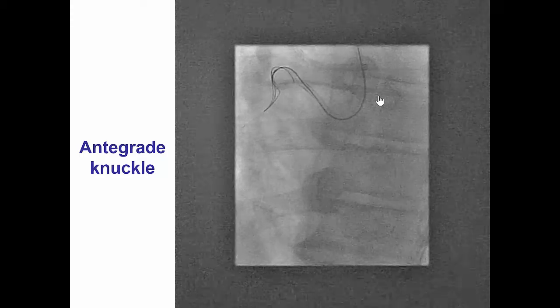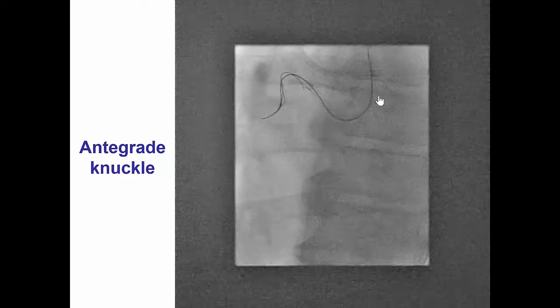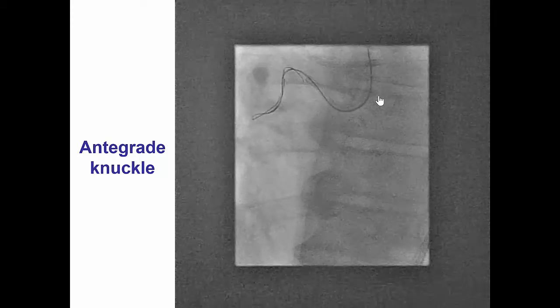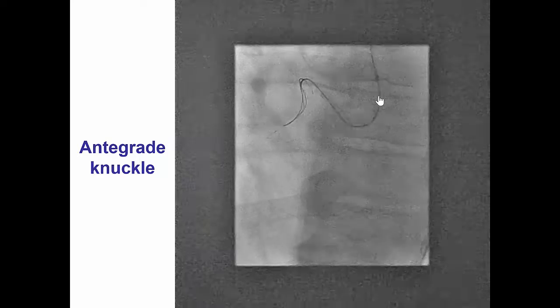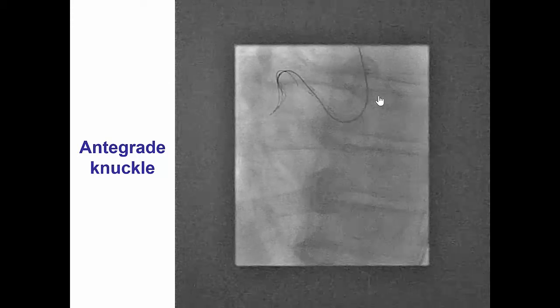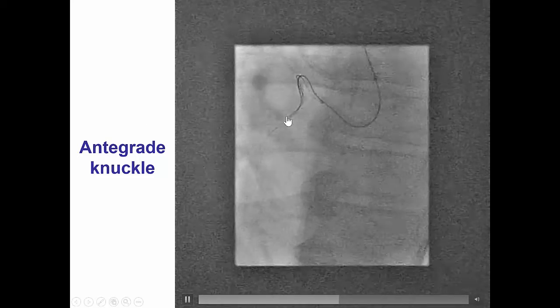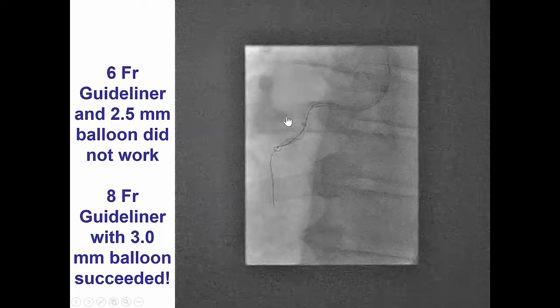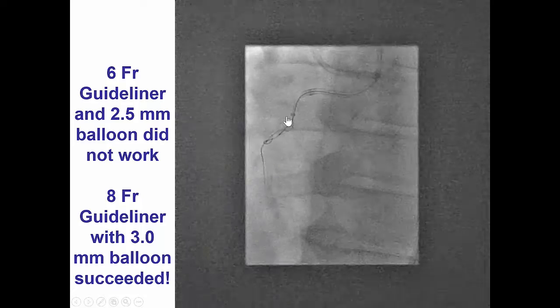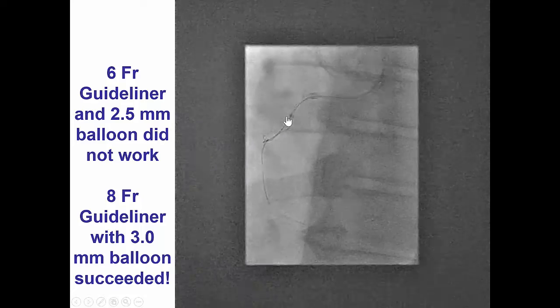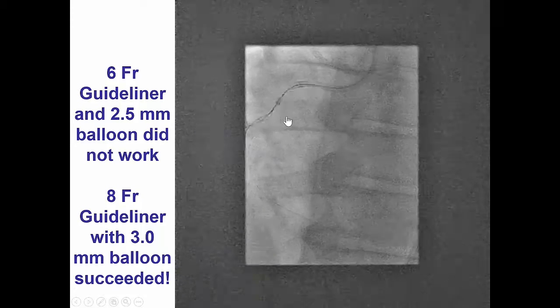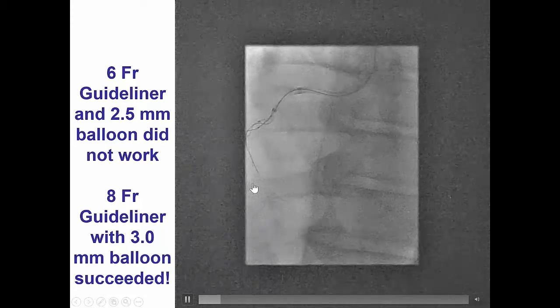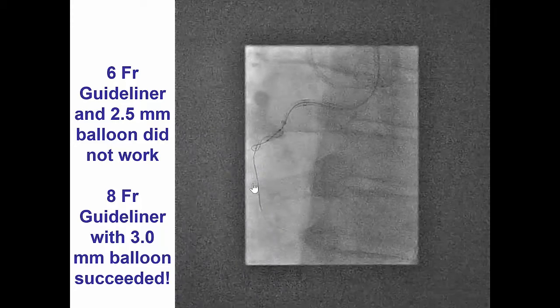Since we now have a marker of the vessel course, which is the retrograde wire, we were able to advance an antegrade wire sub-intimally into the proximal and mid-right coronary artery. We then advanced a guideliner — initially a 6-French guideliner to the mid-right coronary — and attempted to do reverse CART; however, that was not successful.